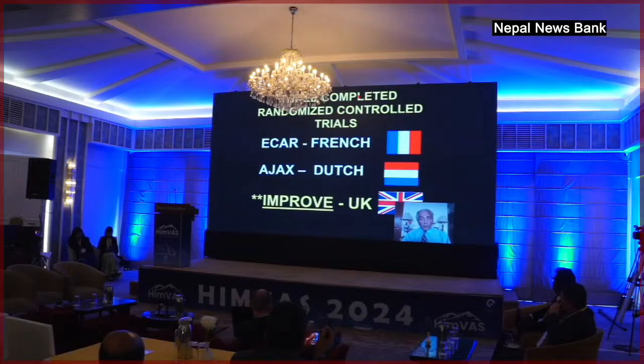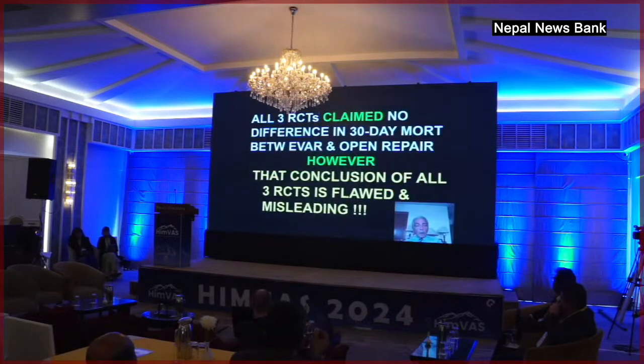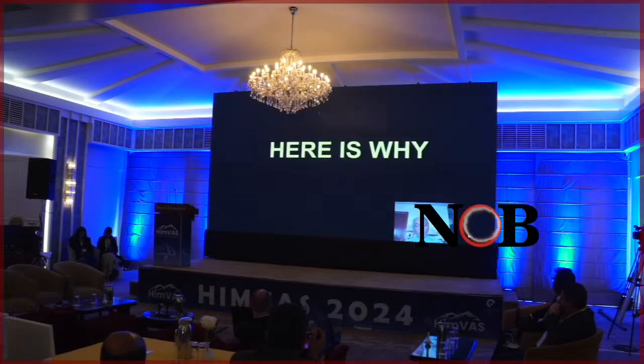These are the ECAR, AJAX, and IMPROVE trials. All 3 trials claim no difference in 30-day mortality between EVAR and open repair. However, that conclusion is, in my opinion, flawed, misleading, and just plain wrong. And here is why.